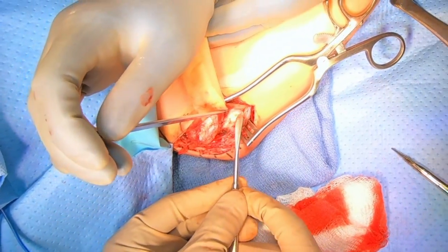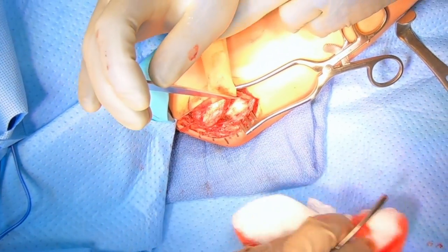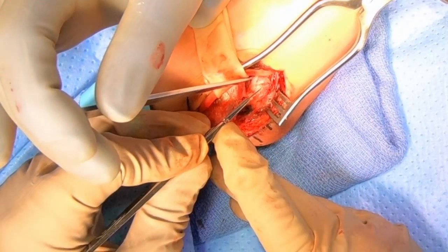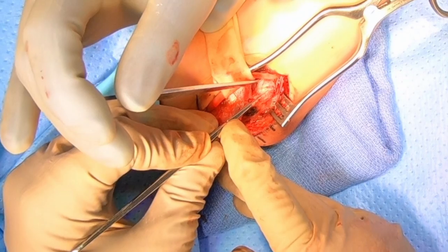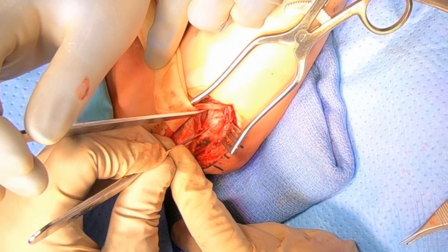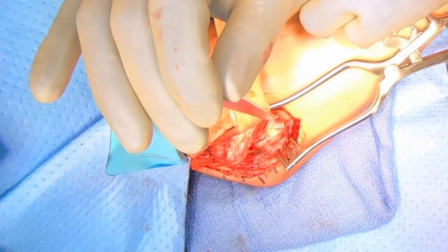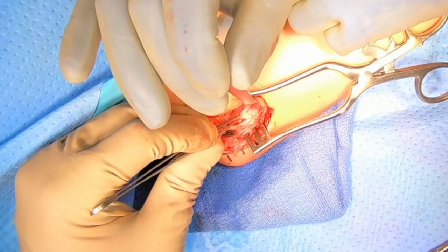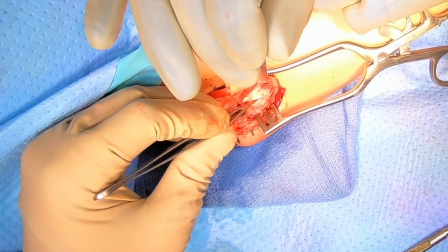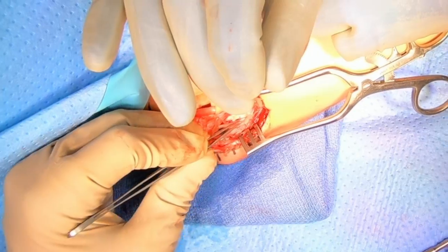You'll see me here palpating to make sure we know exactly where the ligament attaches to the lower arm bone, pointing that out for my assistant. Now we're going to make a cut in the middle of the ligament. This cut is going to allow us to identify exactly where the ligament attaches and also identify the tear within the ligament. Taking my forceps and pulling the ligament on either side, you can see how the ligament is lax — it does not have any tension because it is torn off the lower arm bone side. You can see me there exposing the tear by pulling the ligament down.